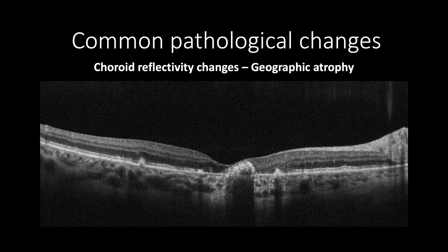The most common reason for the increased reflectivity of the choroid is geographic atrophy. This is due to the absence of the RPE layer to reflect the light. As in this case, dry age-related macular degeneration with drusen in different sizes and RPE atrophy causing geographic atrophy and prominent Bruch's membrane with increased reflectivity of the underlying choroid.